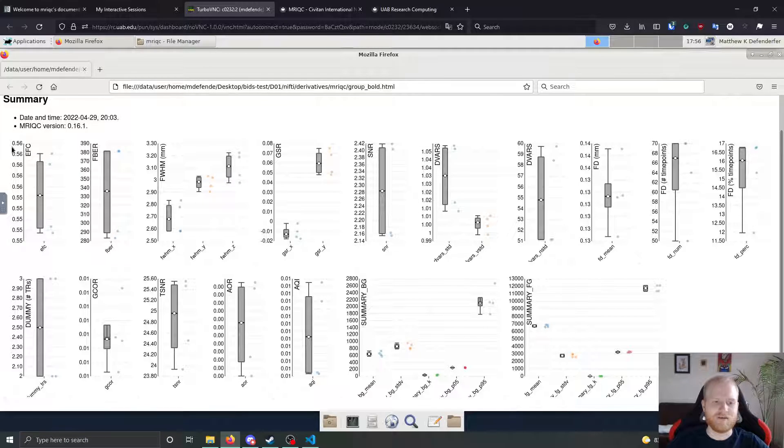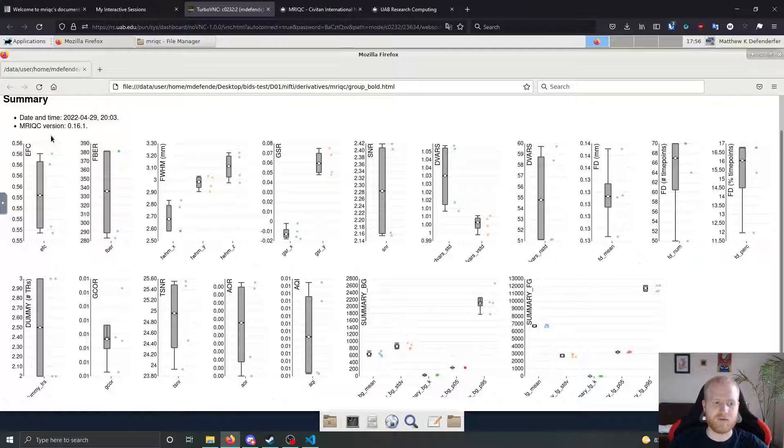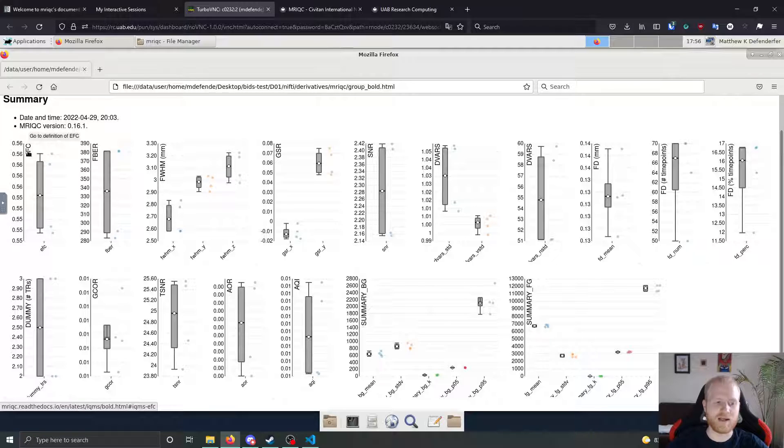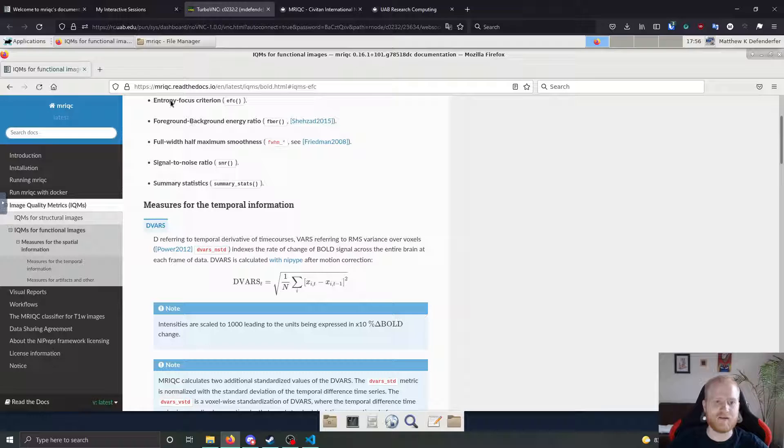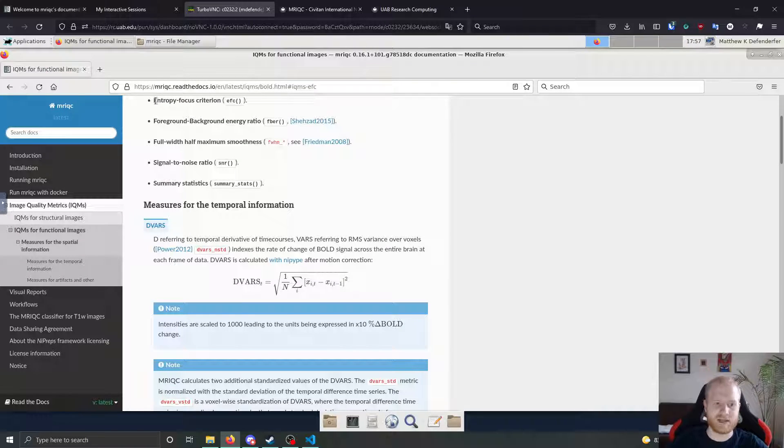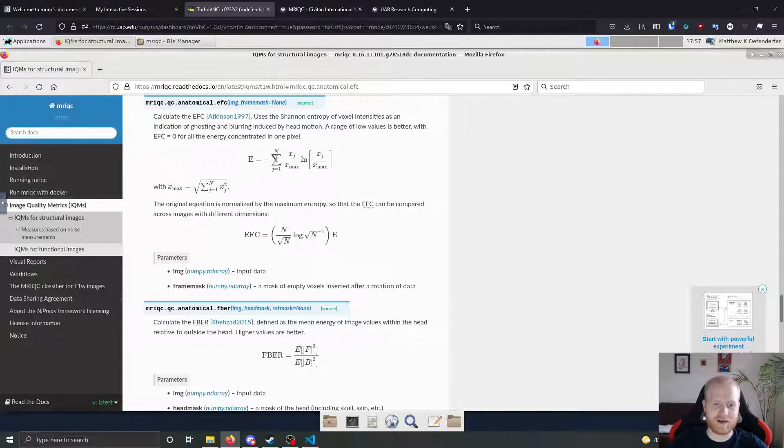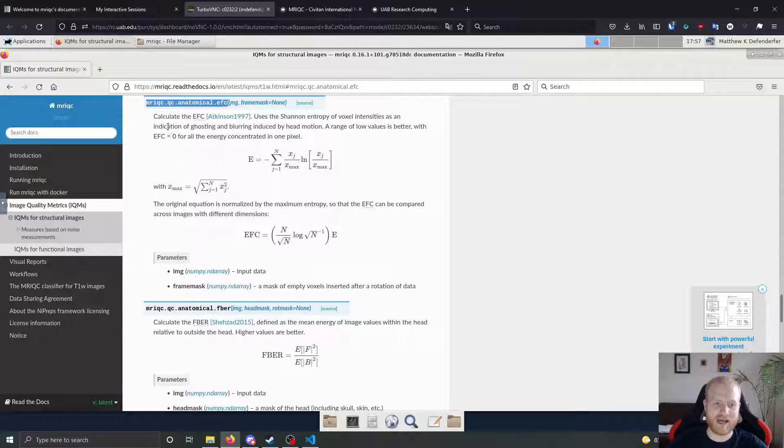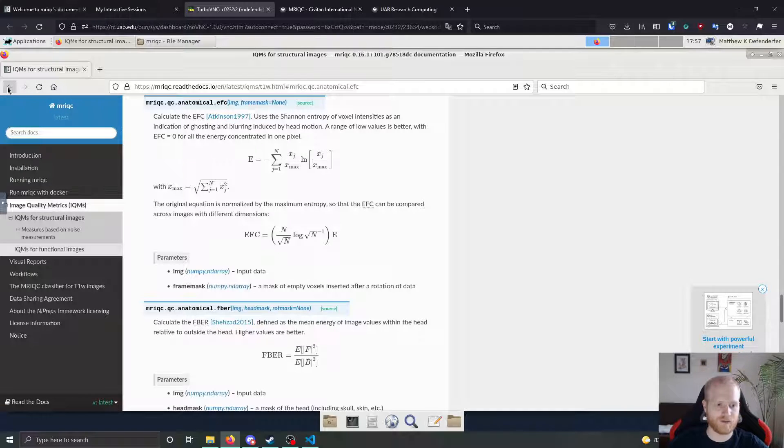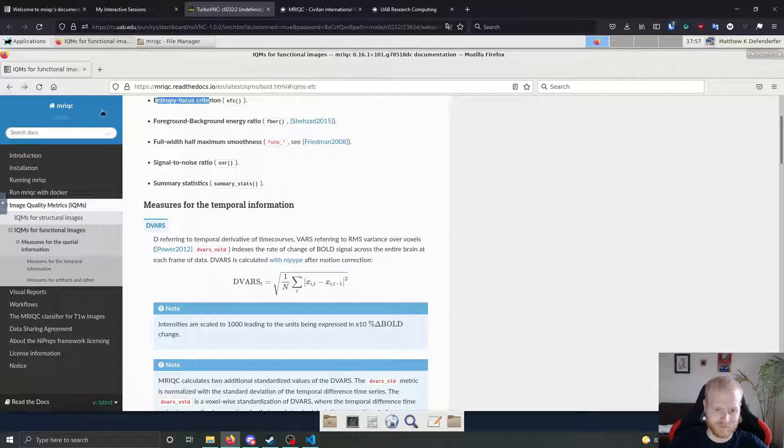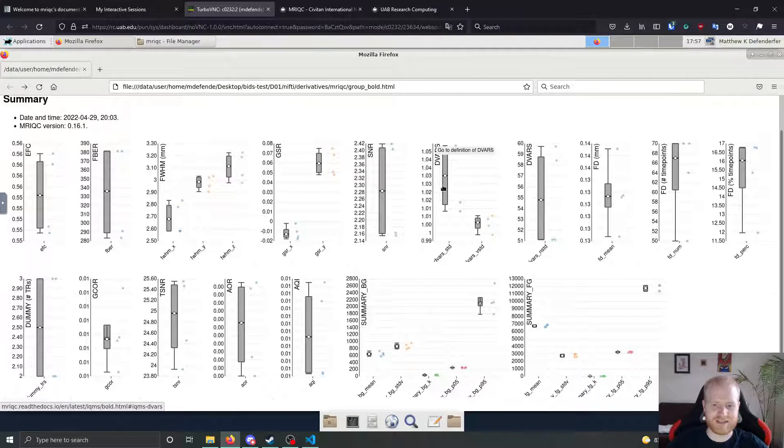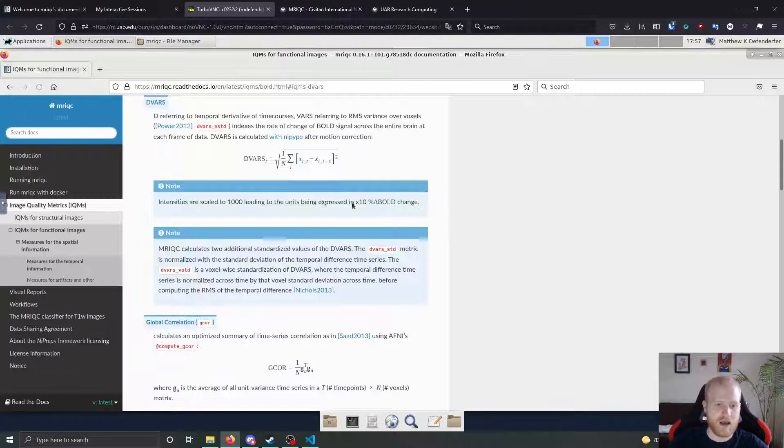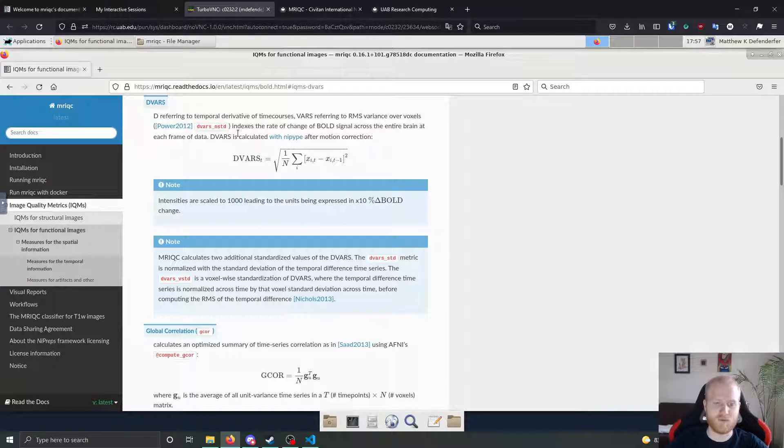And like I said before, all of these are in acronym format. So if you don't know what they stand for, one nice thing about it is that you can click on EFC here and it'll take you to what it stands for, entropy focus criterion. If you clicked on EFC there, it takes you to the function that's used to calculate it. And it'll give you a brief explanation with the mathematical formula, as well as a link to the paper that they got the thing from. If you go back, you can do the same thing for things like DVARs, and it'll give you a nice explanation of what DVARs refers to as well as the paper that it comes from.